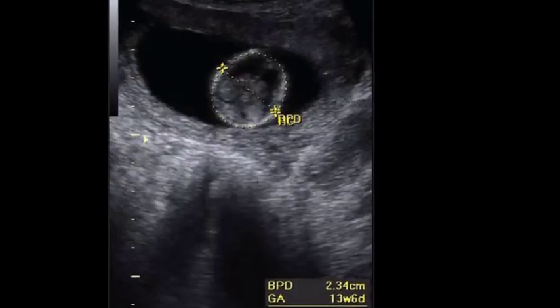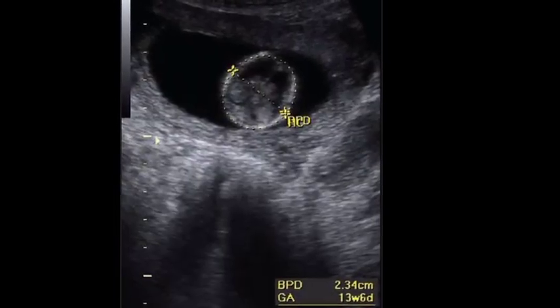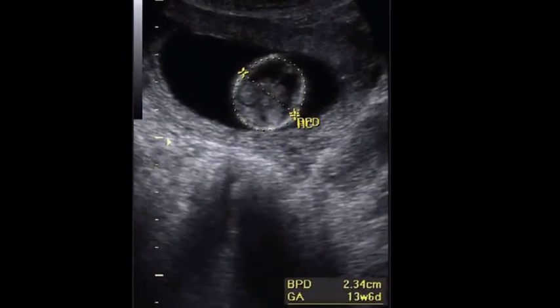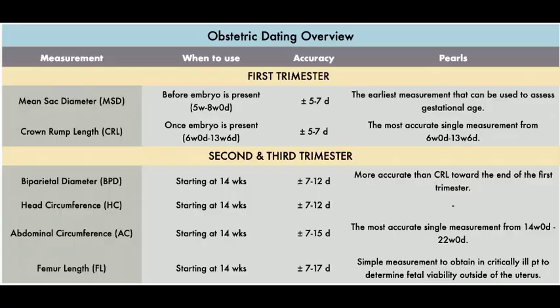The biparietal diameter should be measured as early as possible after 13 weeks for dating. Biparietal diameter has been shown to be accurate in predicting gestational age from 14 to 20 weeks. The variability increases after this time.